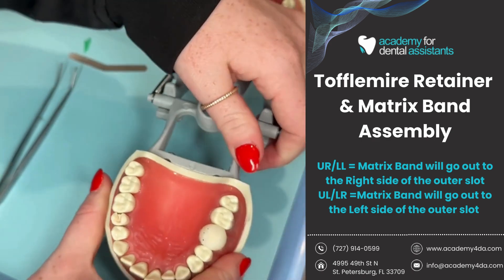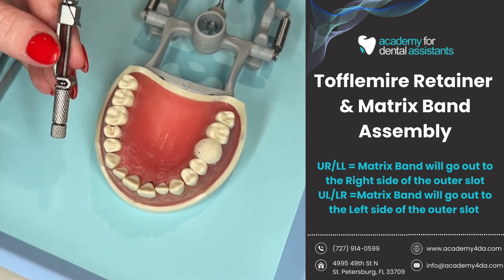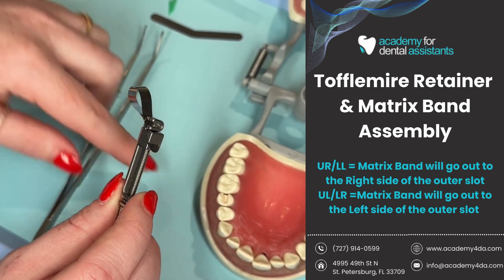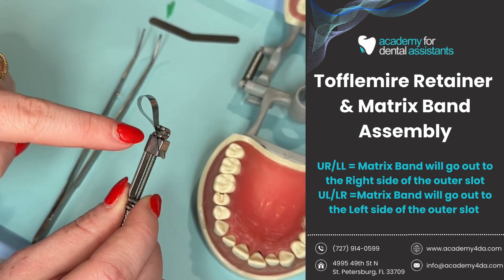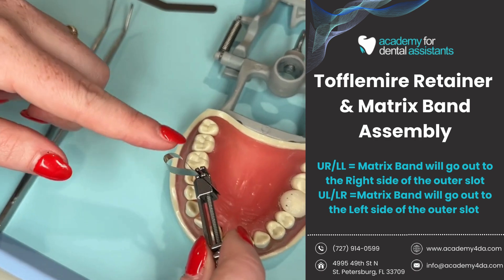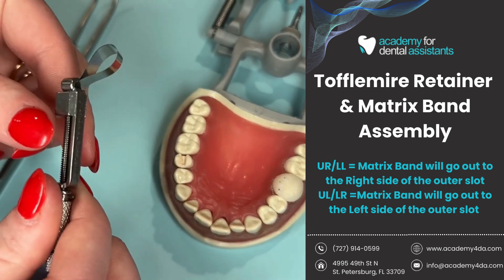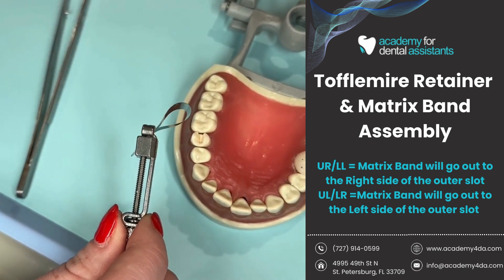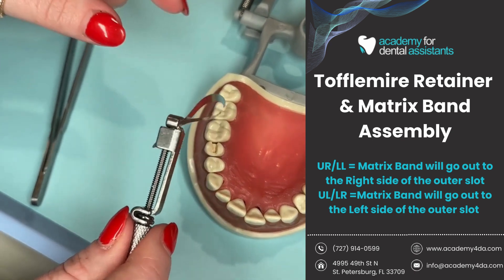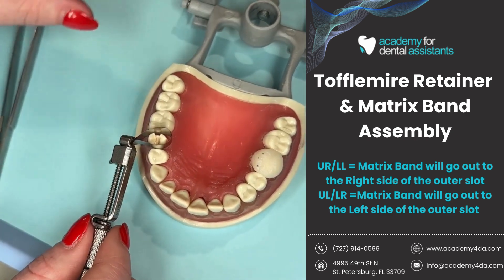Once it's tightened, I'll open it and flip it around so it's easier to see. Now that I have my matrix band and Toffelmyer assembled properly, I always want this U-shape — the outer slot — to face towards the gums. I'm doing this because the smaller circumference side of the matrix band is facing up, which should go towards the gingiva. If I placed it the other way, the small side would face the crown tip instead of the gingiva. My U-shape faces the gingiva, and the smaller circumference goes towards the gums. You also know this is proper placement because the Toffelmyer will be coming out of the patient's mouth towards the midline, not towards the back of the mouth.